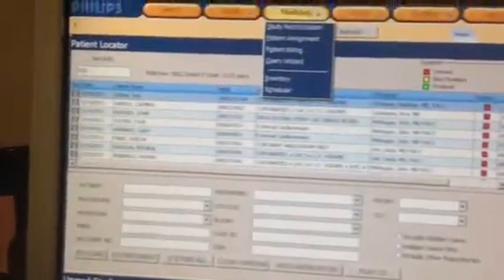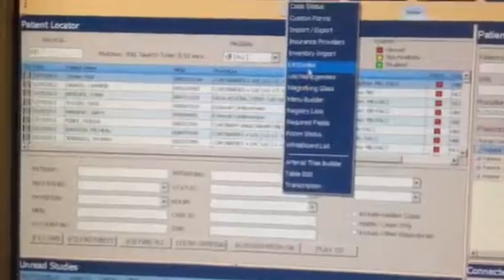Then when it's time for Dr. Lee to do hers, it'll just be the same over here. You'll pick the procedure again.